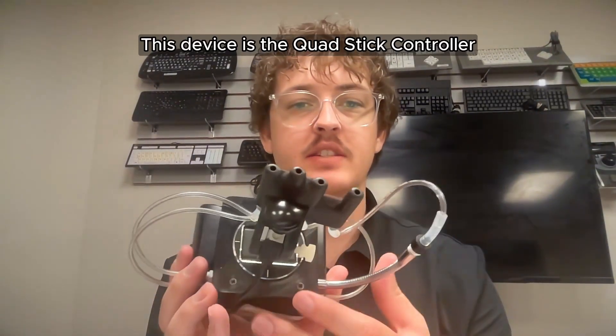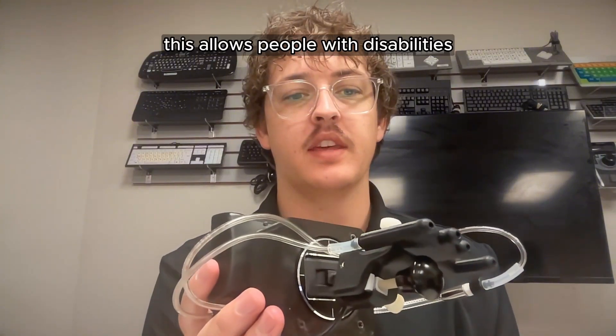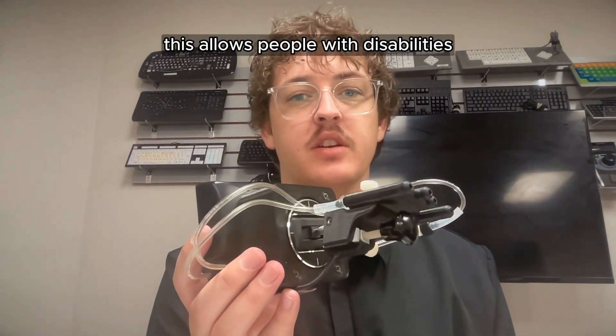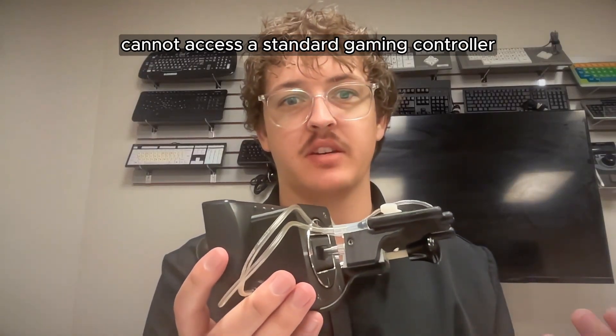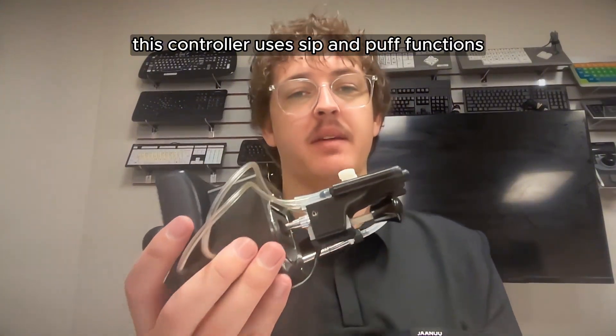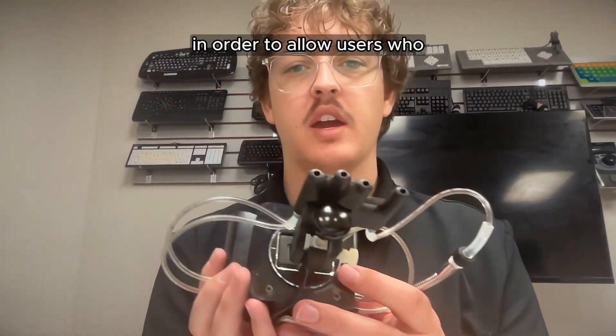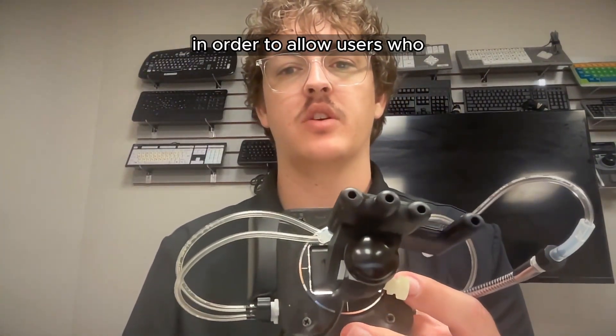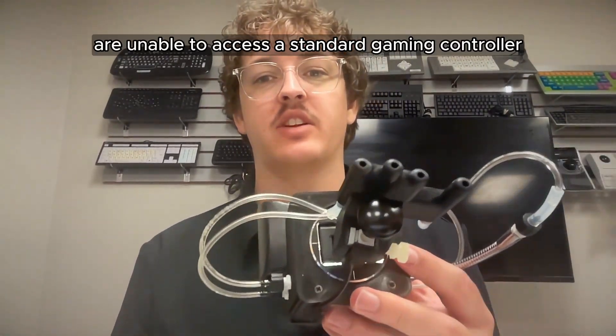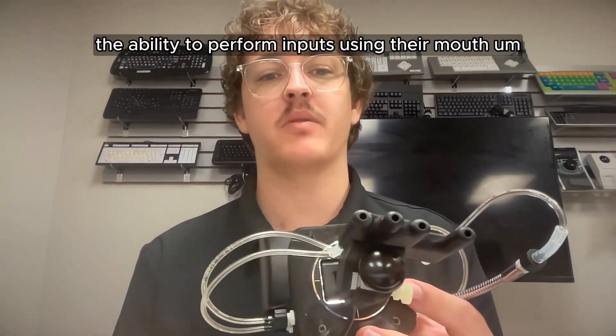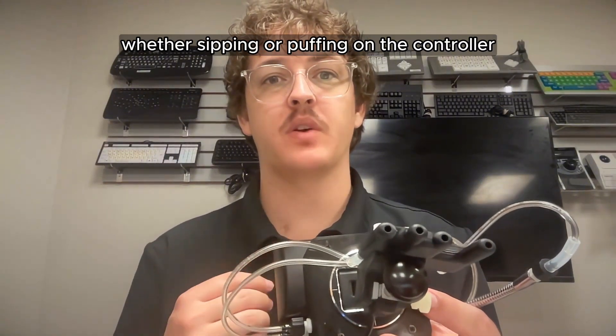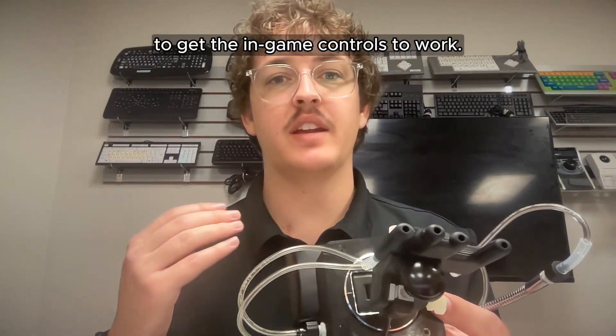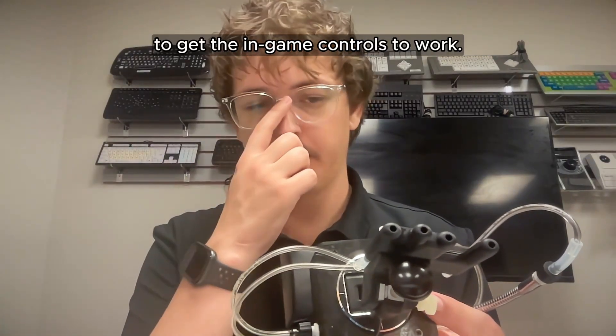This device is the QuadStick controller. This allows people with disabilities to play video games who otherwise cannot access a standard gaming controller. This controller uses sip and puff functions in order to allow users who are unable to access a standard gaming controller the ability to perform inputs using their mouth, whether sipping or puffing on the controller to get the in-game controls to work.